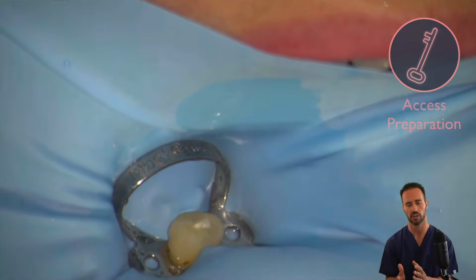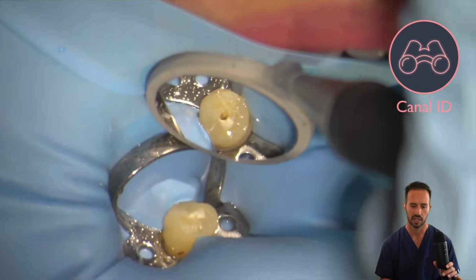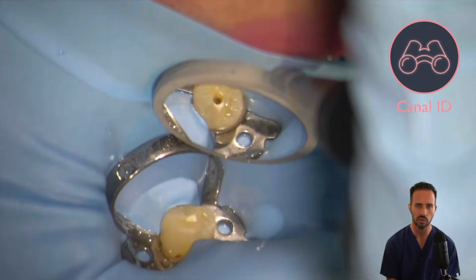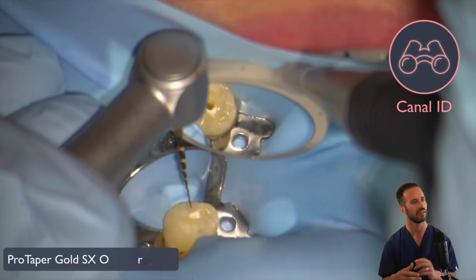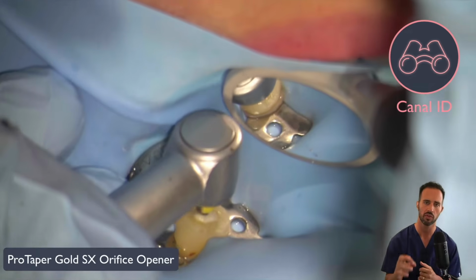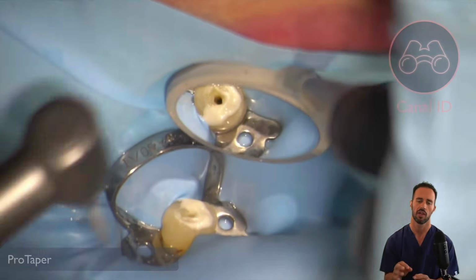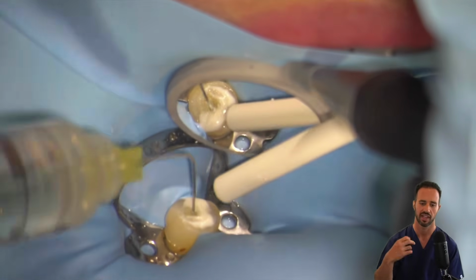All right, and then you're going to start your canal identification. So the first bit of sodium hypochlorite is going to help with dissolving, and it's going to increase your visibility into the tooth. And then we're going to proceed into our canal identification. All right, we didn't even need an Endo Explorer for a case like this because the canal is pretty open. So we're using our ProTaper Gold SX rotary file. That's going to be our orifice opener, and that's going to start the initial component of opening up that canal space so we can get a lot of sodium hypochlorite in there.